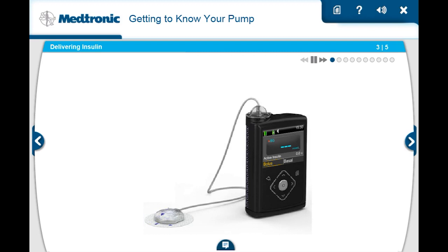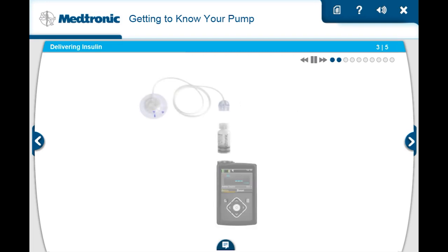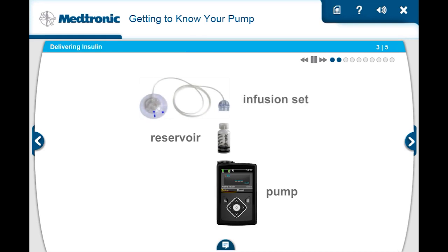Your pump is designed to give you very precise amounts of rapid-acting insulin to help cover your insulin needs. This is done with the delivery system that has three different parts: the reservoir, the pump itself, and the infusion set.